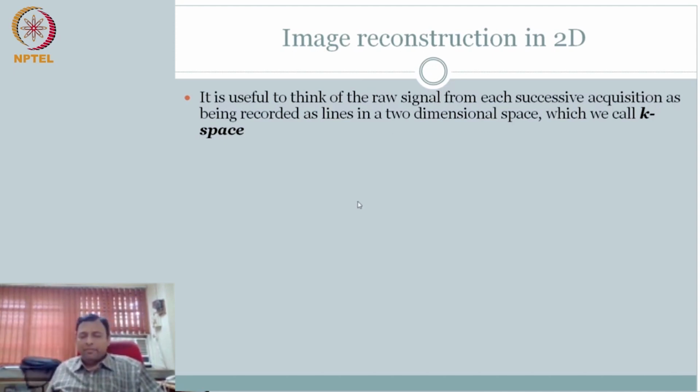I remember we mentioned it's a Fourier space. But in this domain, usually, instead of talking about frequency, right, when you have cycles per second in time, that is frequency, correct? Or the number of cycles in 2 pi radians. But when you talk about spatial variations, not time variations, usually it is advantageous to say number of cycles over a length rather than time, right?